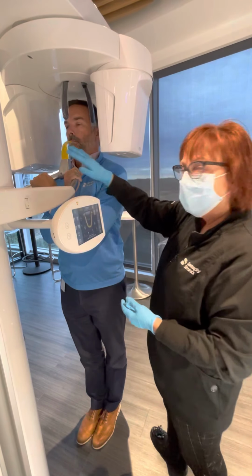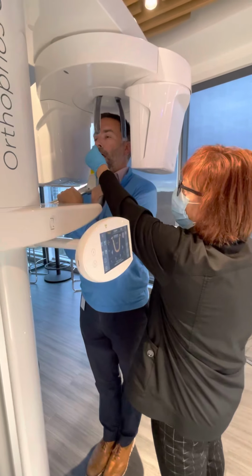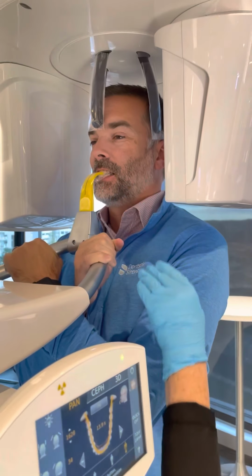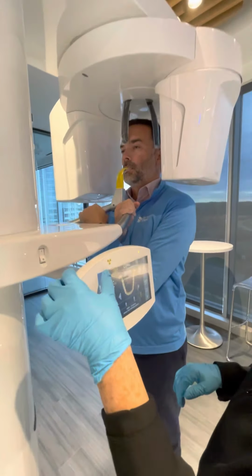So we've done grab, step. Now I'm going to ask him to bite and confirm that he's biting correctly just on the tip of the bite block. Okay, so we've done grab, step, bite. Now I go directly to light.